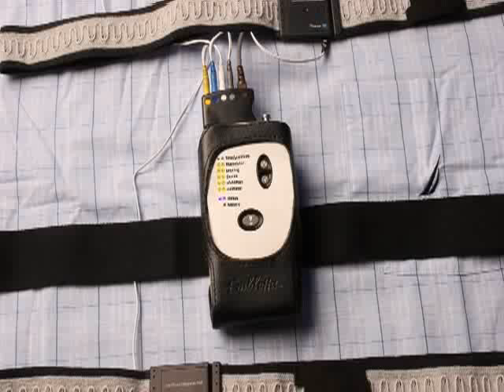A double flashing yellow light means your recording is prepared for the appropriate time and is pending. When the Embletta is recording during the programmed time, or when the start button is pushed successfully, a double flashing green light will appear. A red flashing light or battery light means immediate attention is required, and you will need to contact your Embletta provider.